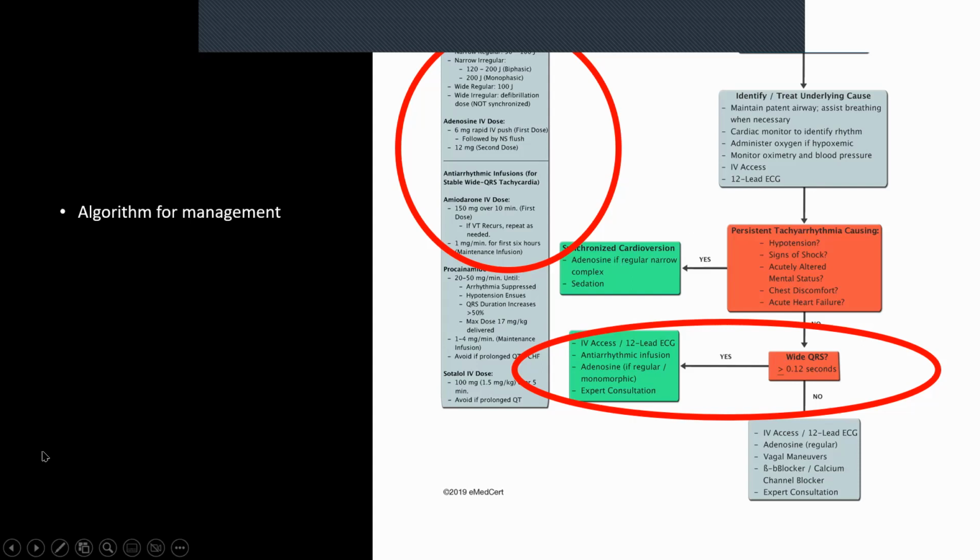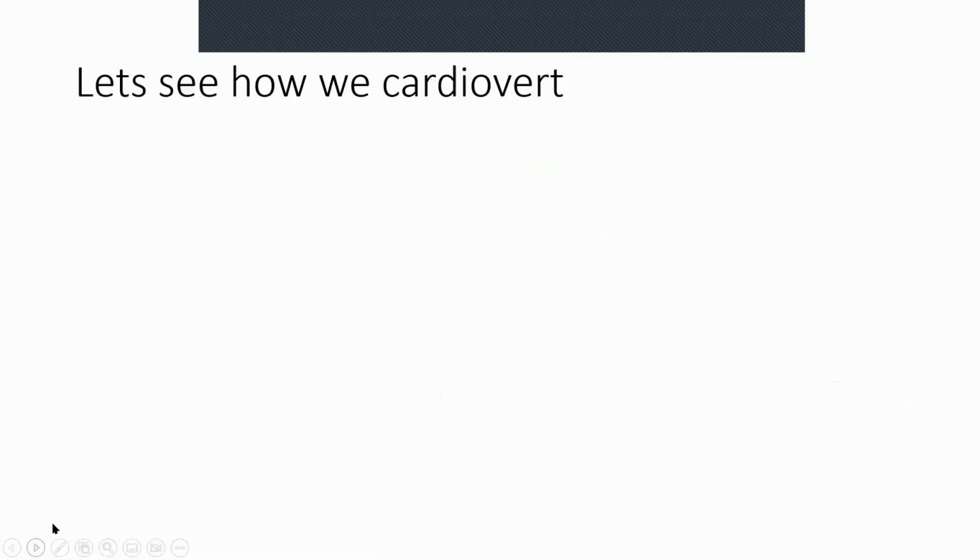So the question is, how do you do a synchronized cardioversion? So let's go into that and see.